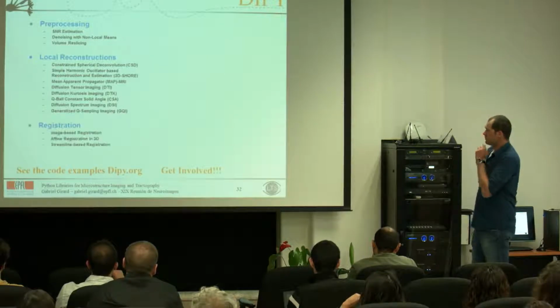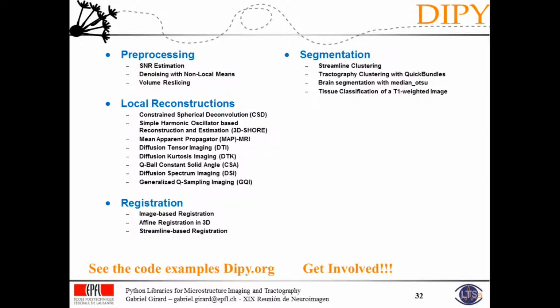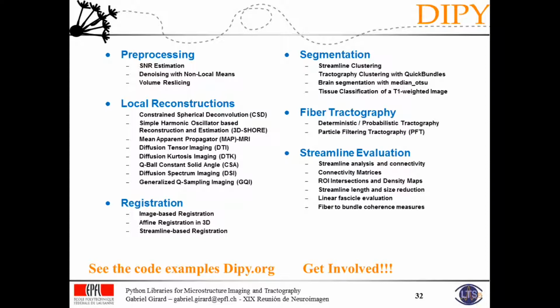So there are many, many other things in DIPY: pre-processing algorithms, local reconstruction techniques, registration tools, segmentation, fiber tractography. I went mostly through those two. Streamline evaluation, computation of connectivity metrics, and so on. Some visualization tools as well. So there's many things to look at.